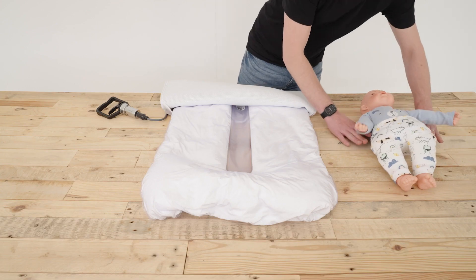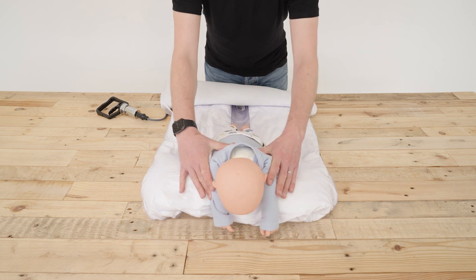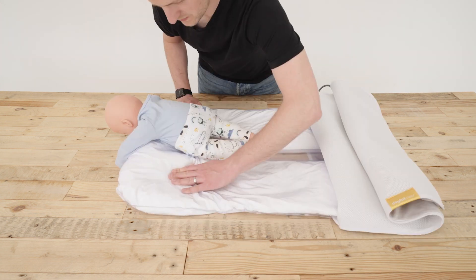Tummy lying. Position the infant at the bottom of the Neo on their front with their arms and head extending beyond the product. Mold the base cushion to provide support under the infant's chest and down their sides.